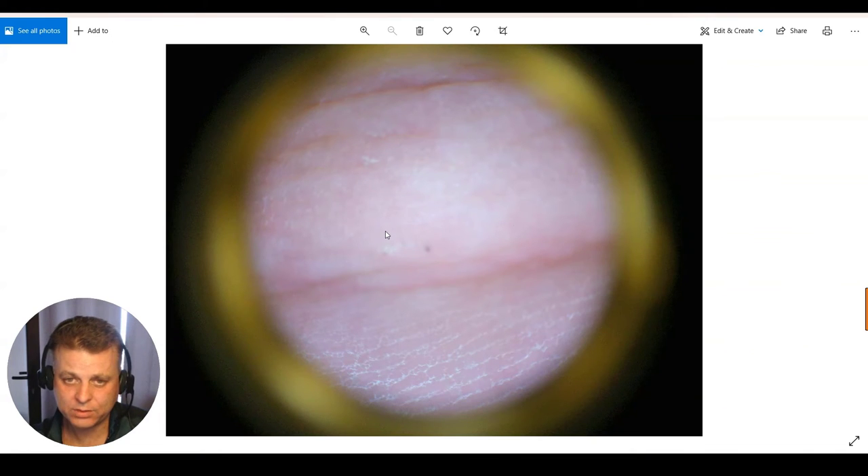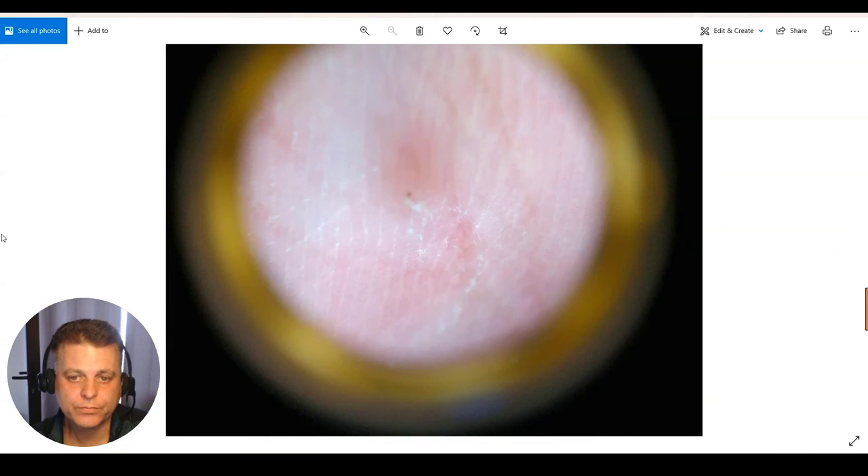This is from the DL100 — not a high-end dermatoscope in the DermLite line — and this is a very typical finding that you would see under dermoscopy: the burrow, and then the scabies mite right there. Let me go to this other photo. You see the burrow and the scaling, and then the scabies mite right there.